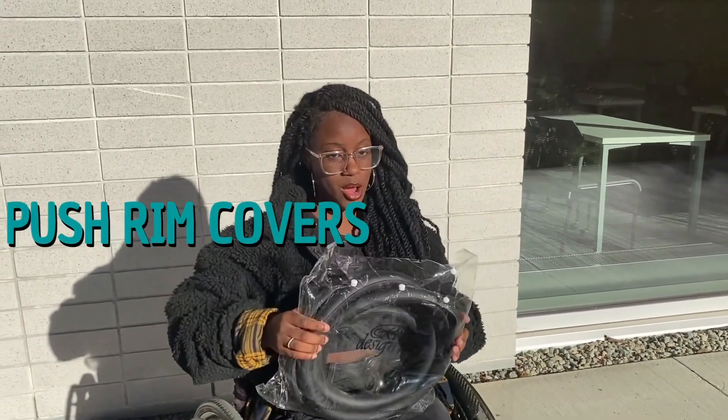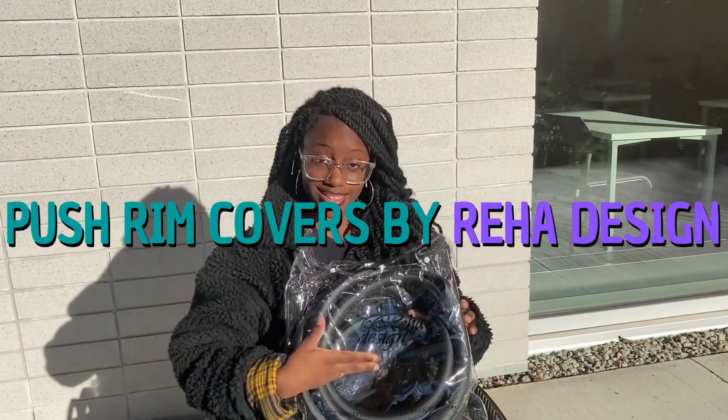So as you can tell by the title, we're going to be reviewing push rims. I got these from Reha Design and I'm super excited to try them out. So let's get on into this video.